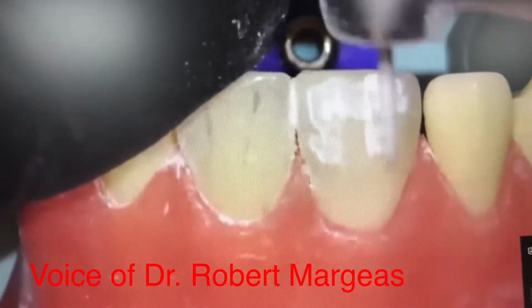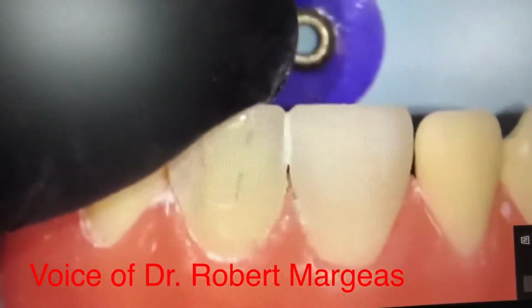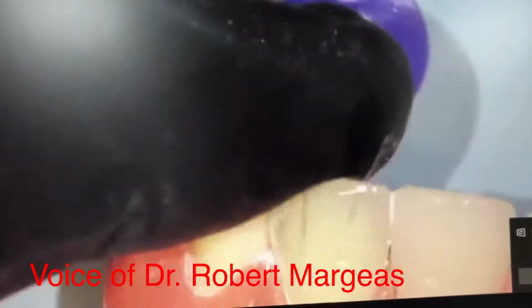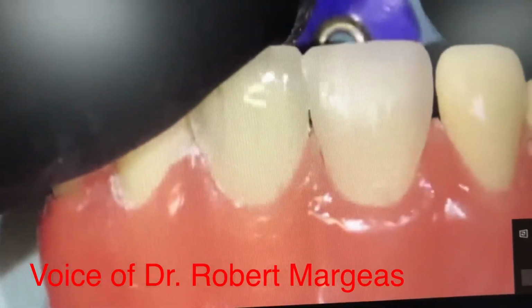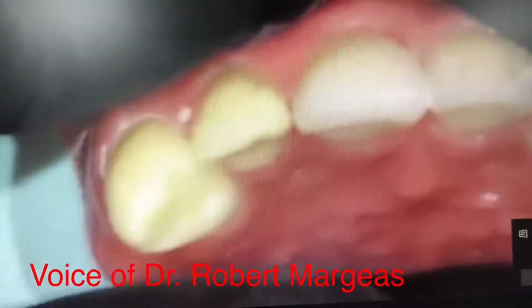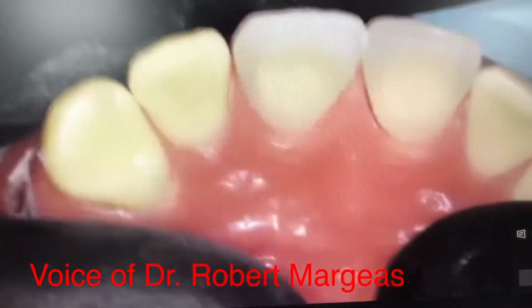So what I want to do is show you this, and you'll start to see it shine similar to the adjacent tooth, where it's just very little depressions. Look at the depressions on here. You can see it with my black background.